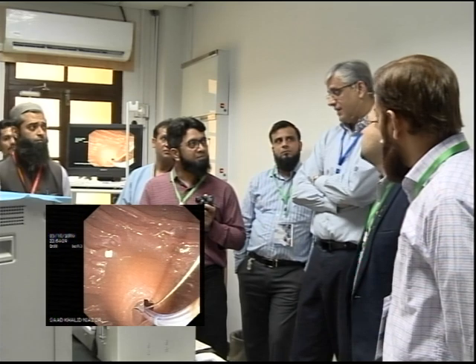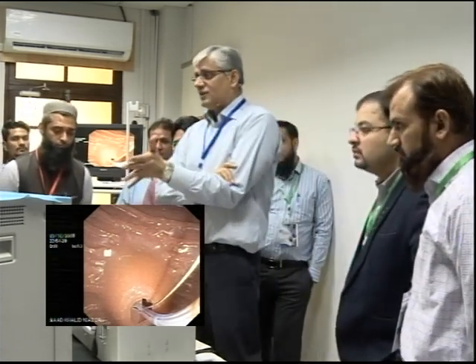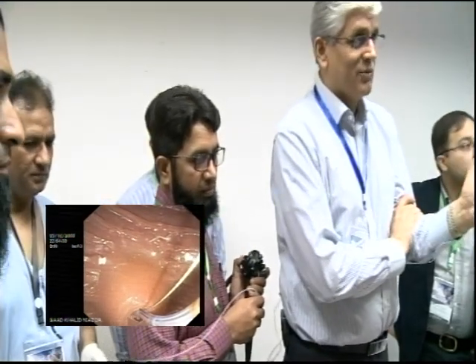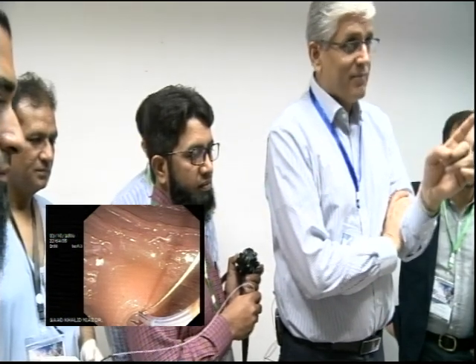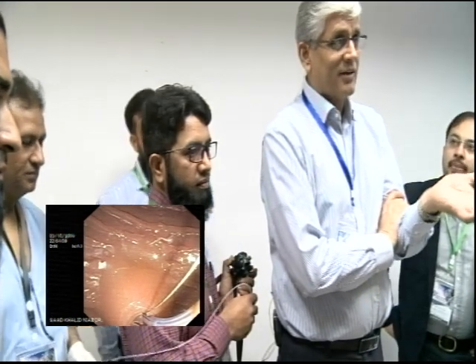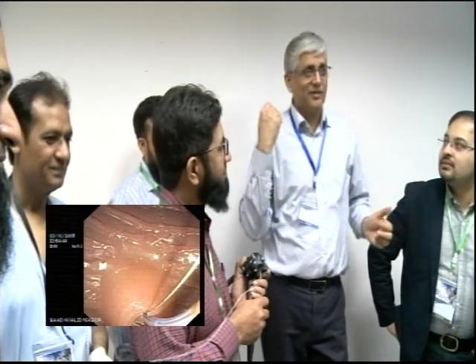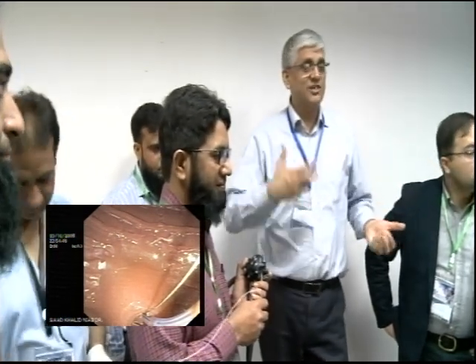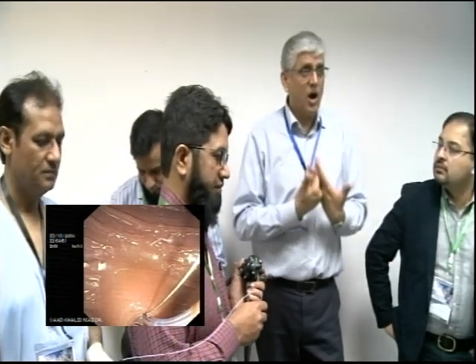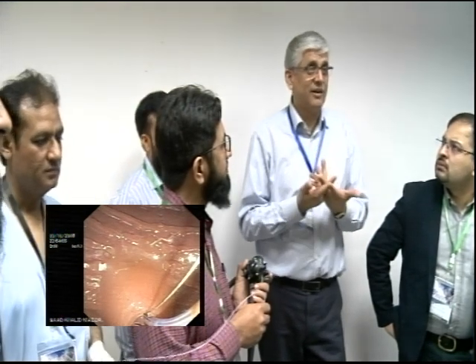Okay, so you are in the pancreas. Now this is something that's very good, because no matter what you do, sometimes you will not be in the duct you want, and no matter who it is in the world. Okay? So it's very important to check. Because you don't want to go into the pancreatic duct and think, oh, great, wire's gone, good, and keep doing something or inject without realizing. Because if you're not sure, there is no harm in injecting in the pancreatic duct, but you should know you're injecting in the pancreatic duct.